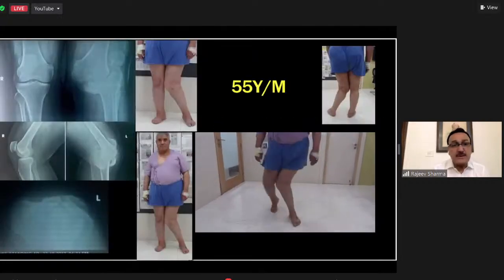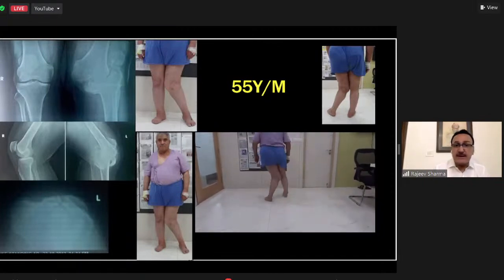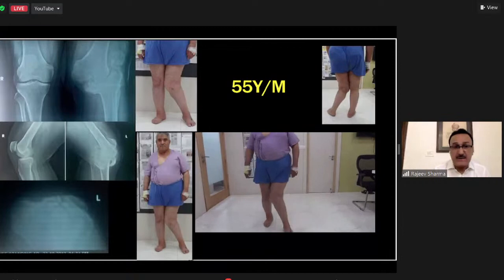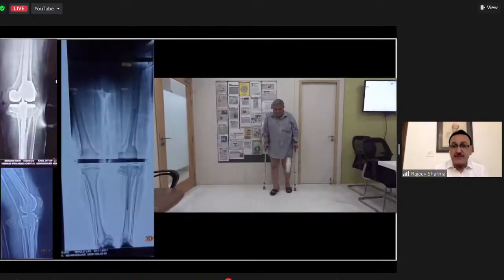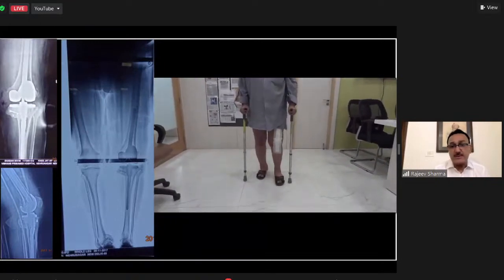The example is this patient with a proximal tibial fracture. The patella is subluxating laterally. It's a very bad stiffening, with significant valgus. Now, in this kind of case, it is probably very wise to be prepared with a constrained knee implant, as in this case, and then you will have a good function in this patient.